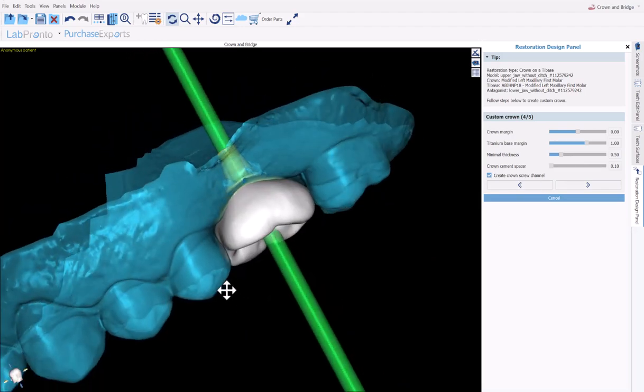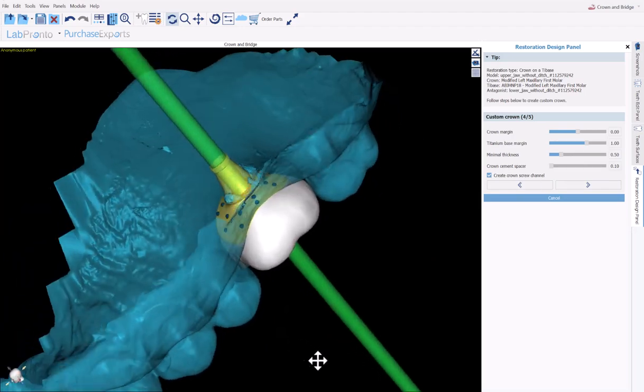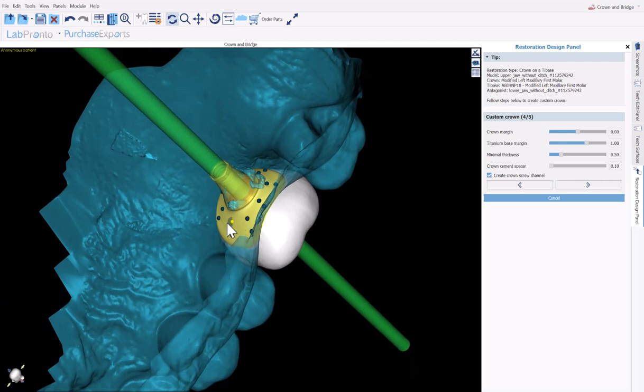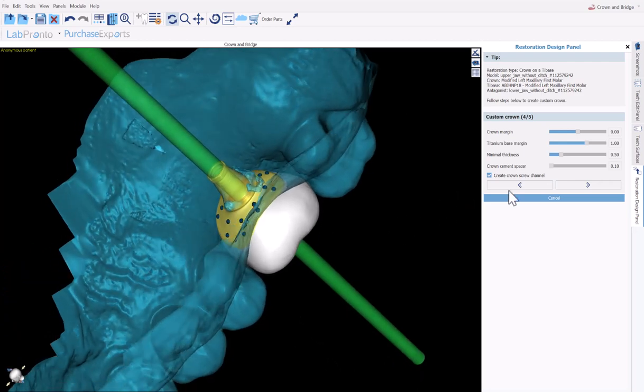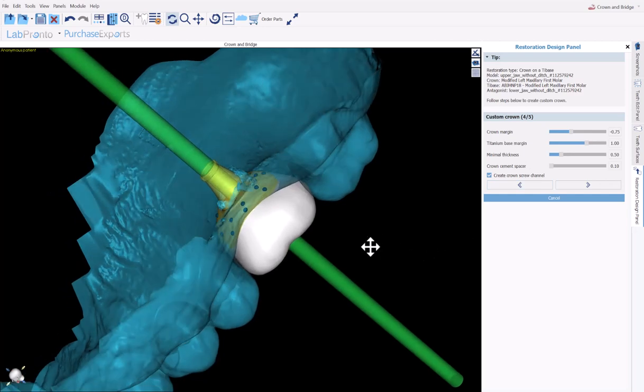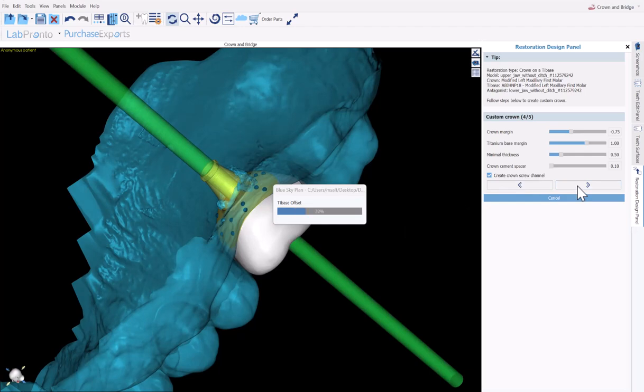We are now at the point of designing the connection. The connection can be modified simply by grabbing and dragging any of the nodes here with your left mouse button or by using the sliders. Select the option if you would like to create a crown screw channel and then click on next.